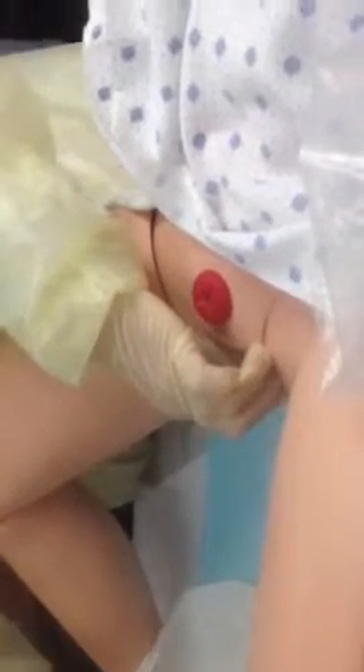So now I'm ready to insert it, and I'm going to take my sterile hand. I'm going to gel it up here where I put my KY jelly or the lubricant, get it all gelled. Students get upset because the box is falling, it's slipping around. Don't get upset — that can go wherever you want. You want to keep this as clean as you can, and you don't want to let go of the labia. Then you insert it here in this meatus without touching the labia. It came back out — I can't put it back in.